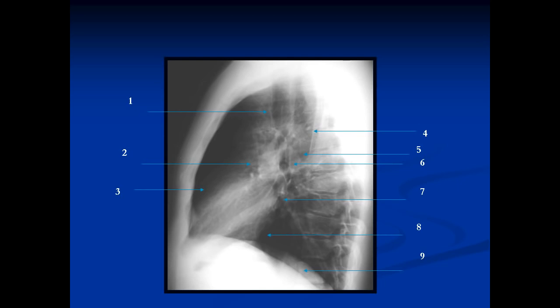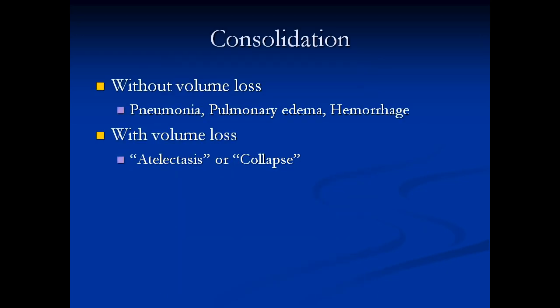I want you to look at the spine as well. If you go down the spine, you'll see that it gets blacker from the top to the bottom — this is normal. When you have an area of consolidation, this will change. Finally, you look at the retrosternal space — the retrosternal space should be uniformly black.